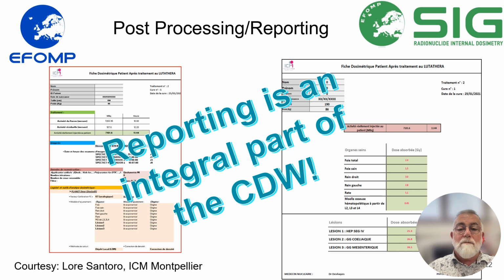So I would stress that reporting is an integral part of the clinical dosimetry workflow, and it's very important to select, if you can, a software that actually does an automatic reporting of a procedure, because again, it decreases the chances of a mistake when you are just copying the results in a report.